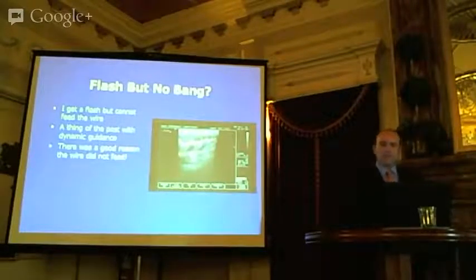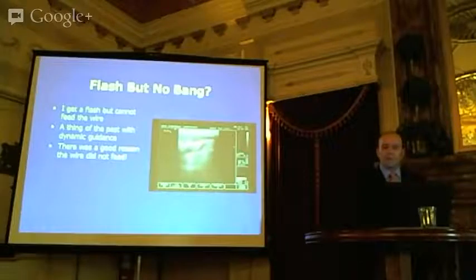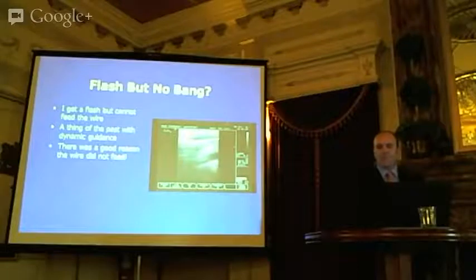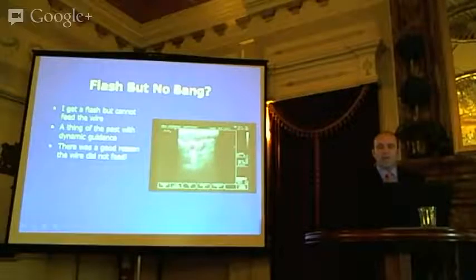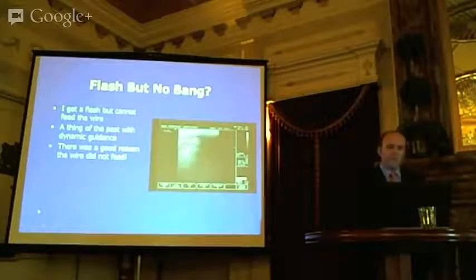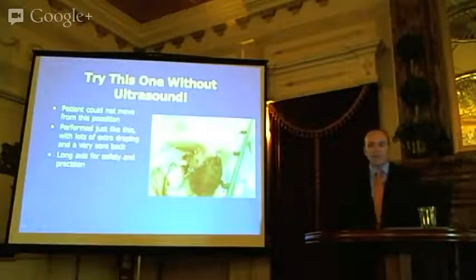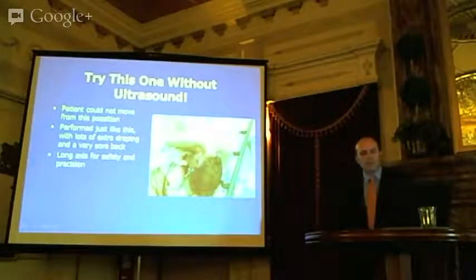This is a line that didn't go so well. Line cannulation pulled blood back. And look at this. There's just enough blood superior to this thrombus that my fellow attending at this time was jabbing the needle in. He could almost get the wire down. He just couldn't push all that clot off to the lungs to get it out of there. So it is very helpful to be able to look at ultrasound. You're not going to do this blindly with ultrasound.